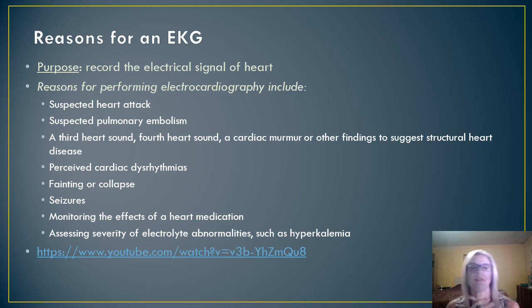Some of the reasons that this might be run are things like if they think you're having a heart attack, pulmonary embolism, fainting spells, even things like seizures. Electrolyte imbalances can absolutely cause these. Things like hyperkalemia, or elevated potassium levels, can really affect your heart rate, even different medications.